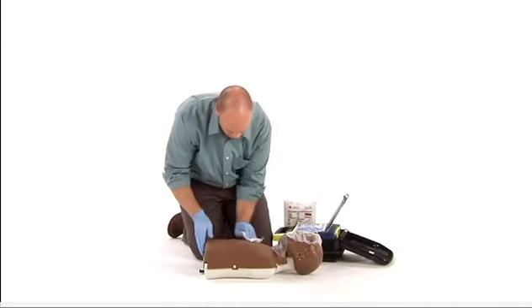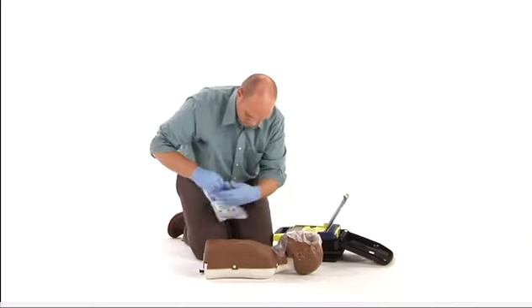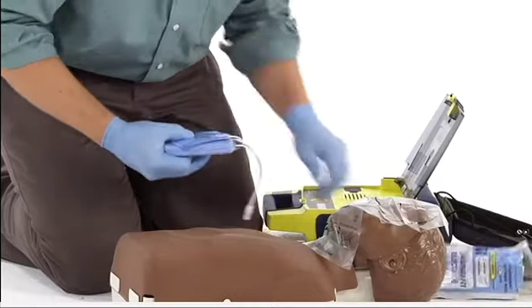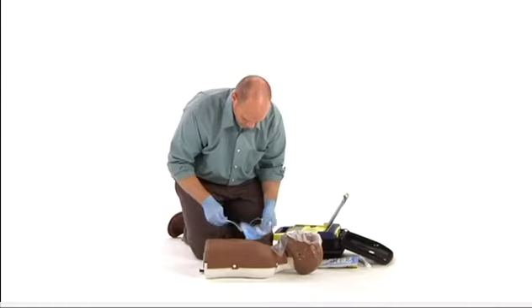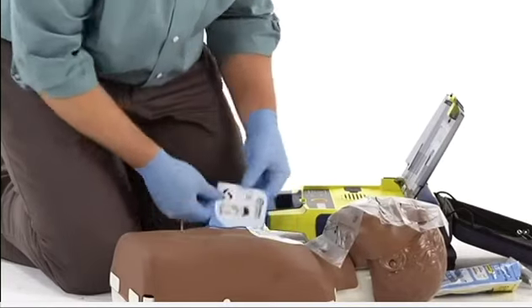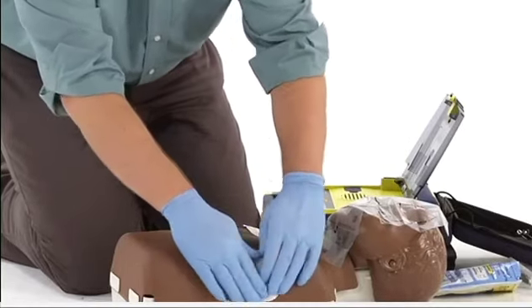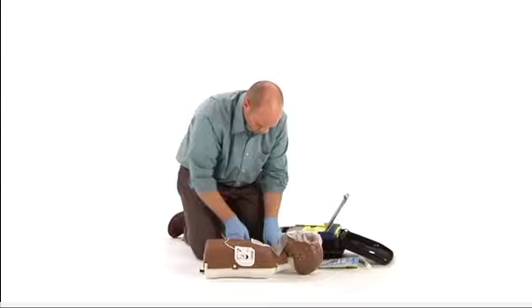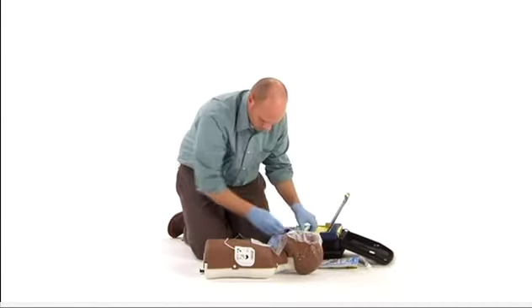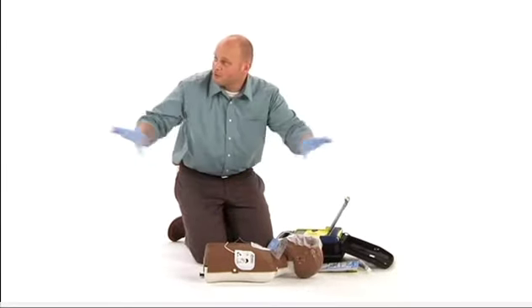An AED can also be used for children and infants who are not breathing. Use pediatric pads if they are available. Operate the AED and apply the pediatric pads to the child's chest the same way you would for an adult. Do not touch patient. Analyzing heart rhythm. Everyone stand clear.